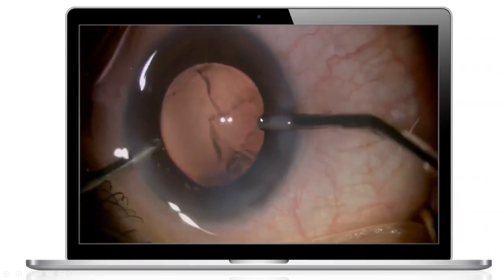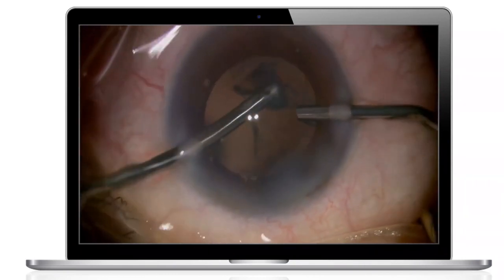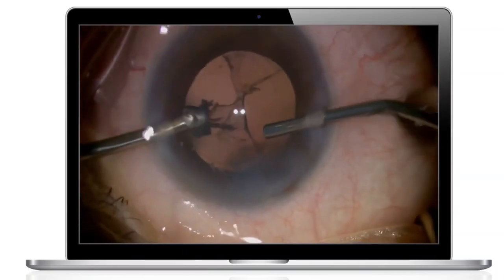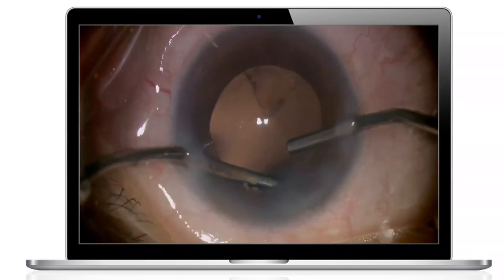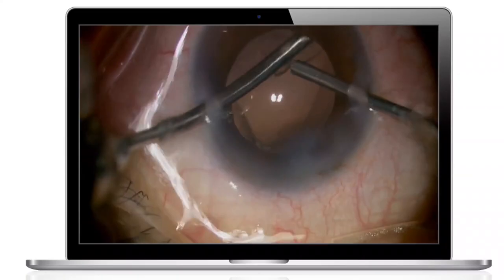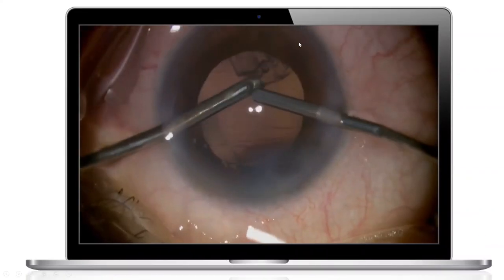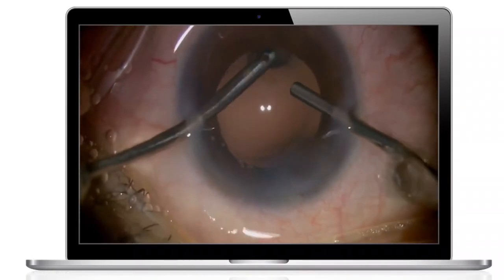Don't remove it from the periphery. So just sweeping movement, engage the cortex and eat in the center. Sweeping movement, engage and eat in the center. And always take the cortex from above. Don't let the cortex which is at the posterior capsule tempt you to engage it. Always go to the equator and engage from the equator. Otherwise, it can end with a posterior capsular break.